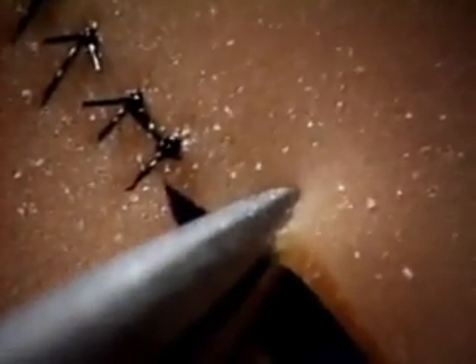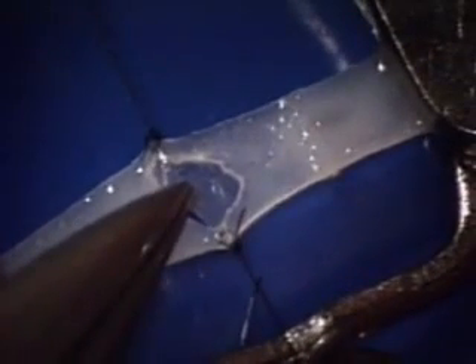Picking up the outer layer is easier on vessel wall than on rubber because you have the adventitia to hold on to. One way not to pick up the tissue is to grab its full thickness — if you do that to real vessel wall, you'll cause serious harm.